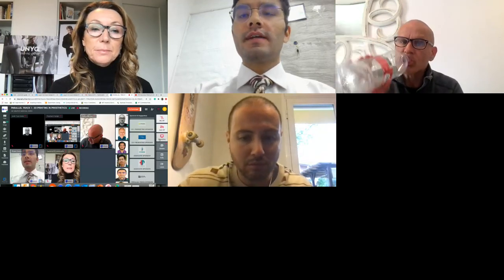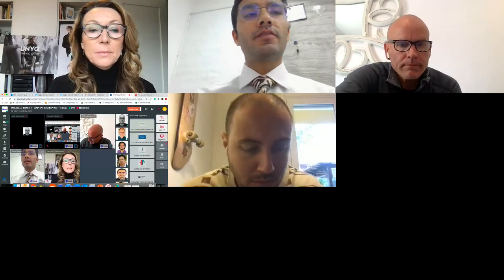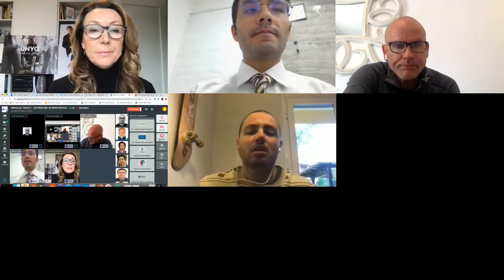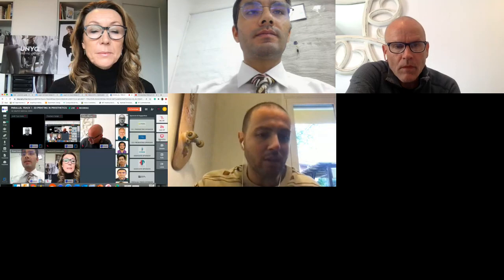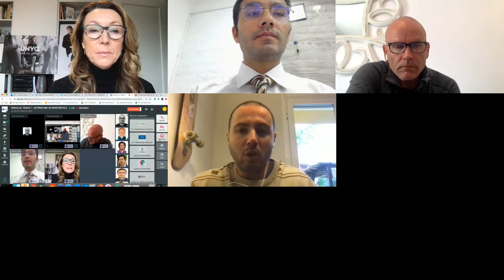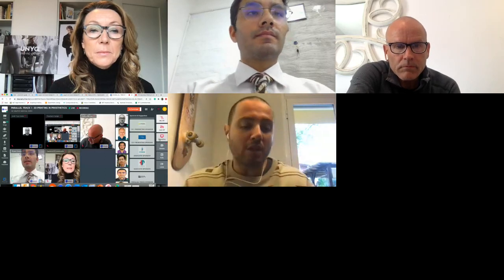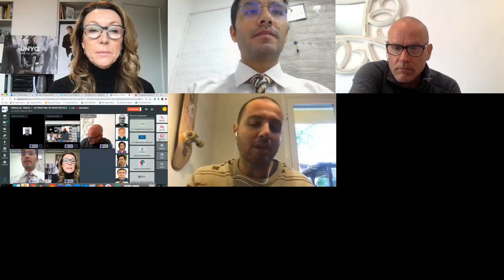Right. Thank you so much for that. So I was just wondering, is there a need for a CT scan or an MRI of the patient as well, or does your system work independently of that? No, I mean, on one side, you have the MRI or the X-ray. Okay, this is one thing. We are not checking anything inside the body. You make your evaluation of the injury the same way that you are doing right now. Okay. What we are doing is taking the surface mesh, and this is what makes the capture, and after that we apply the software to generate the immobilization.